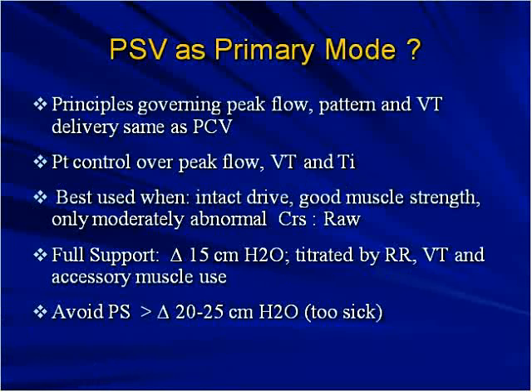To me, that indicates that a patient is probably too sick for pressure support. And the thing to remember is that in pressure support, because it's a spontaneous mode, the patient cannot use the ventilator like water wings or a kickboard, what a kid would use when they're first learning how to swim. They get tired, they can kind of coast on the ventilator. Here, the patient is forced to work much harder or continuously, because if they're not pulling in, they don't get any support from the ventilator.